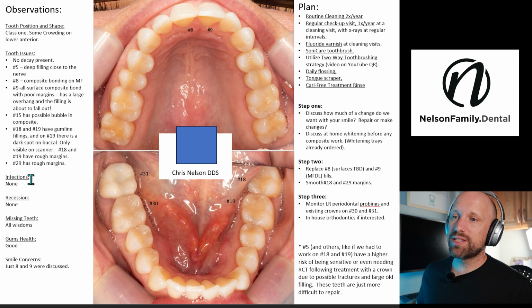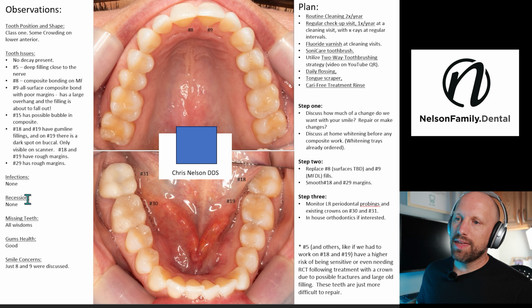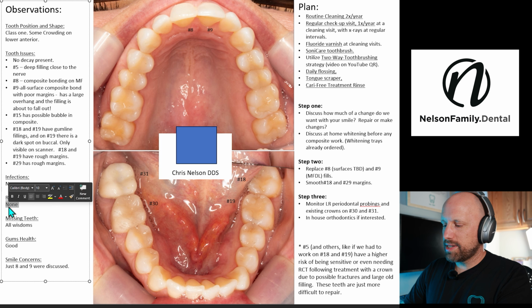So there aren't any infections. There's not really much recession at this point. Maybe a little bit of generalized recession, but not too bad. And then there are wisdom teeth missing.